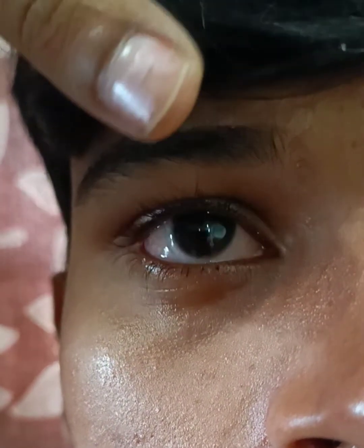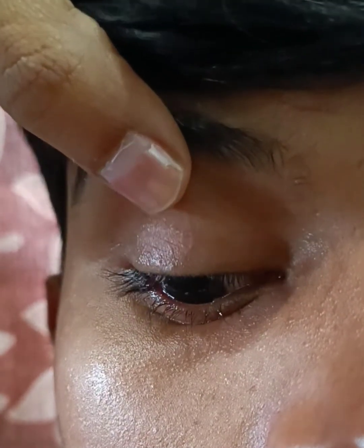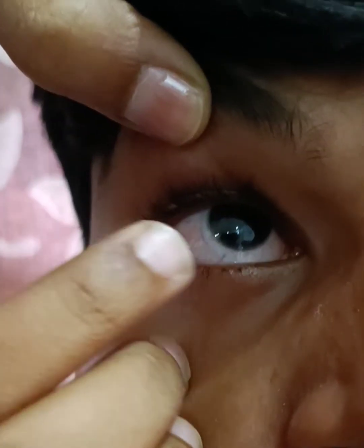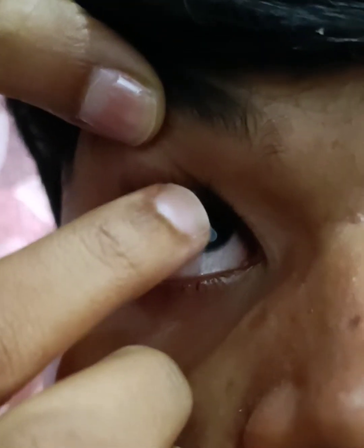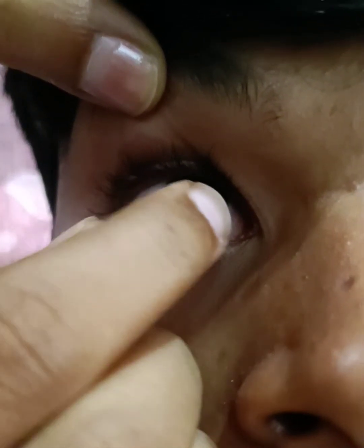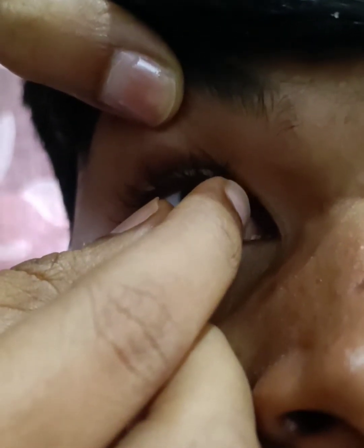The next step I am going to show is the removal of the contact lens. In removing the contact lens, you are supposed to tell the patient to look up. Once the patient is looking up, you have to move the contact lens downward with your index finger and then pinch it off using the thumb and your index finger. And that's how the removal is done. Thank you.